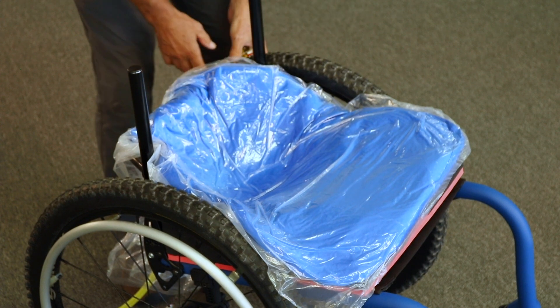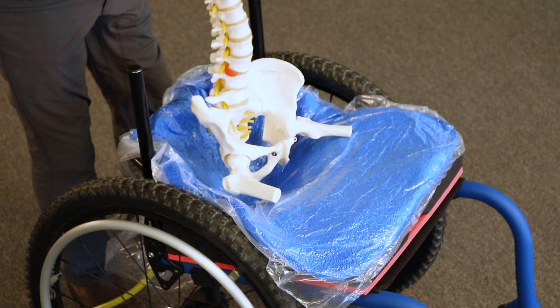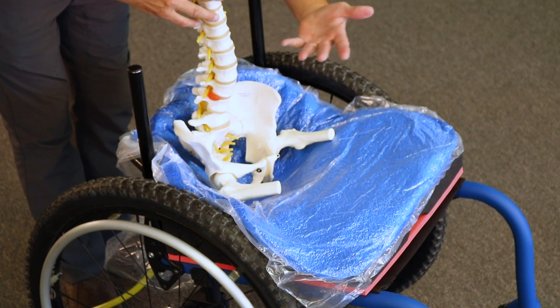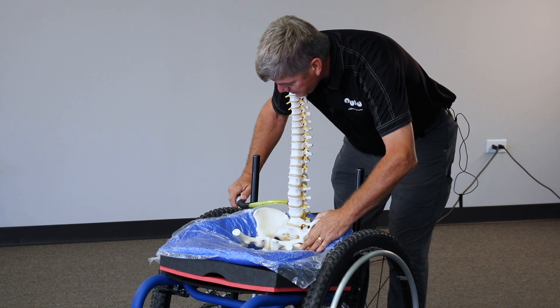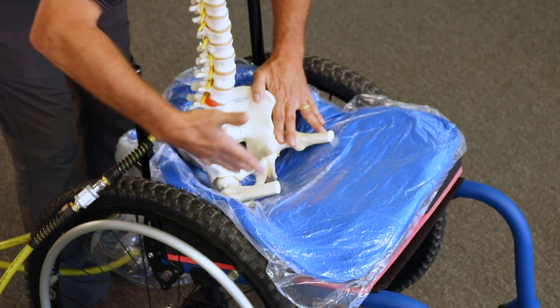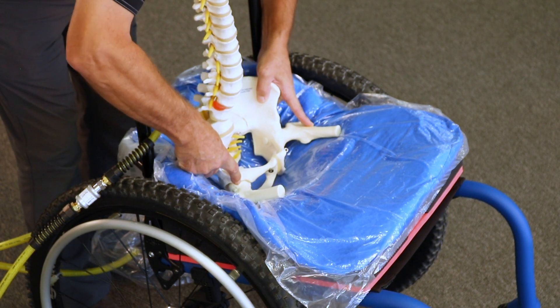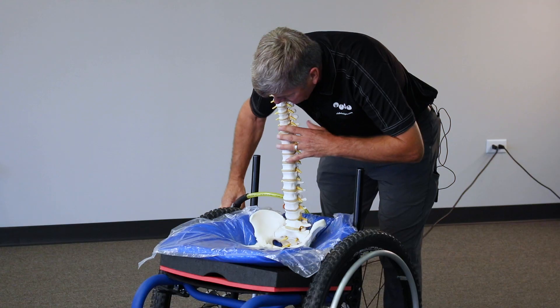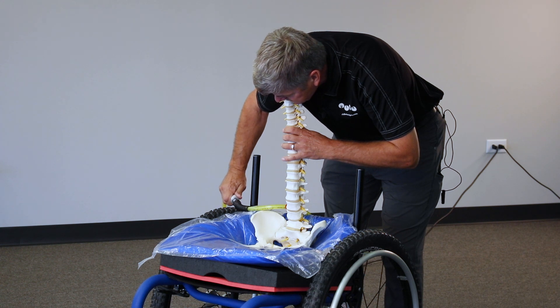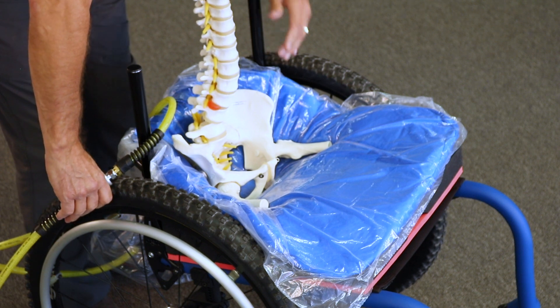The next step is I'm going to lock the bag in place. At this point, the client transfers into the chair into the shape capture, and they're already very low in this capture. From here, I'll let all the air into the bag. The beads start releasing. Then we go to a hip swish — left and right, and then back to center again. Start pulling some of the vacuum in. What just happened is all the beads just rushed in underneath the pelvis to fill that space in between the client and the capture bag.